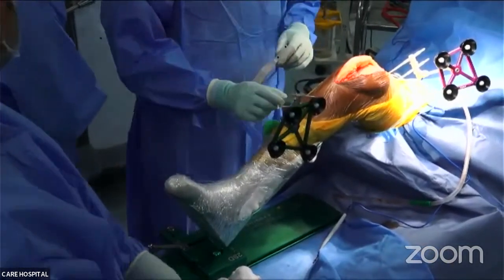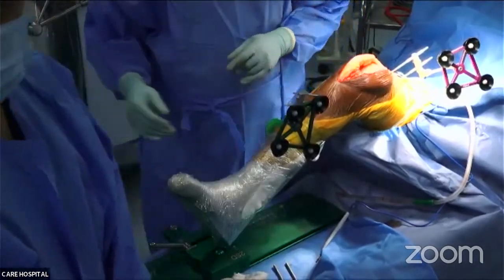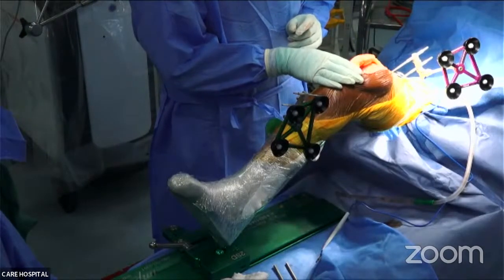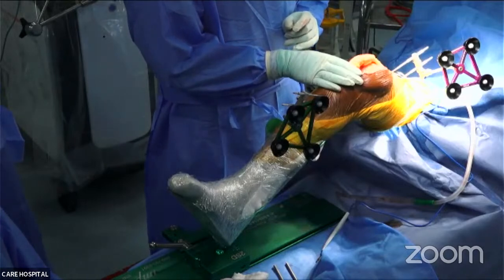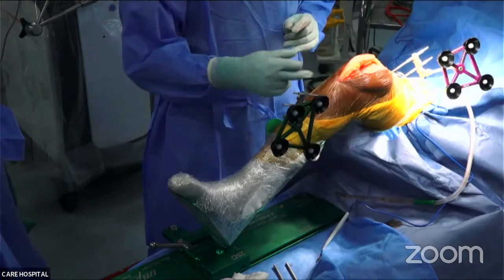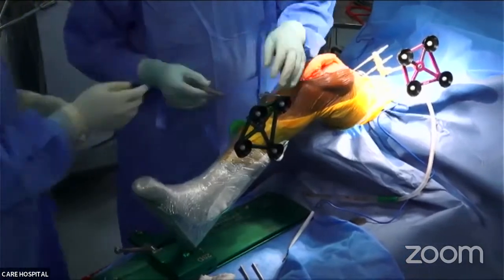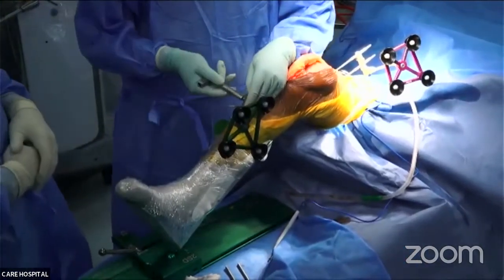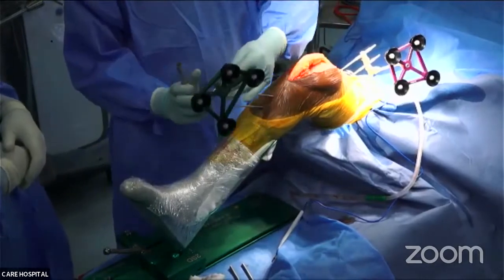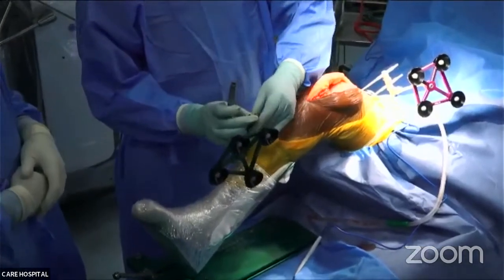What is the site actually? How do you prefer the site? So it is approximately 4 fingers from the joint line. To be on the safer side, I have taken approximately 5 fingers, so that they don't come in the way of the robotic arm. That's how you put the pins first, and you take care that they are unicortical, because there is a chance of stress fracture if these are bicortical.